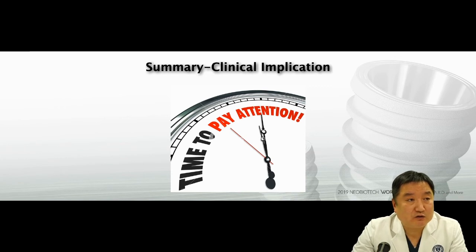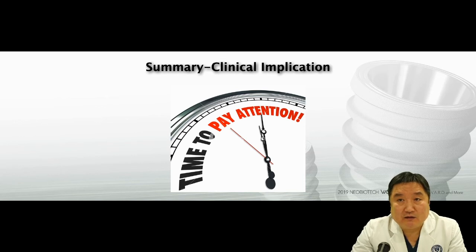Or if you use this photofunctionalization device to rejuvenate the surface, it will be very helpful, I believe. So time-related substantial degradation of bioactivity of titanium draws impending attention for exploring potential clinical implications and possible solutions.